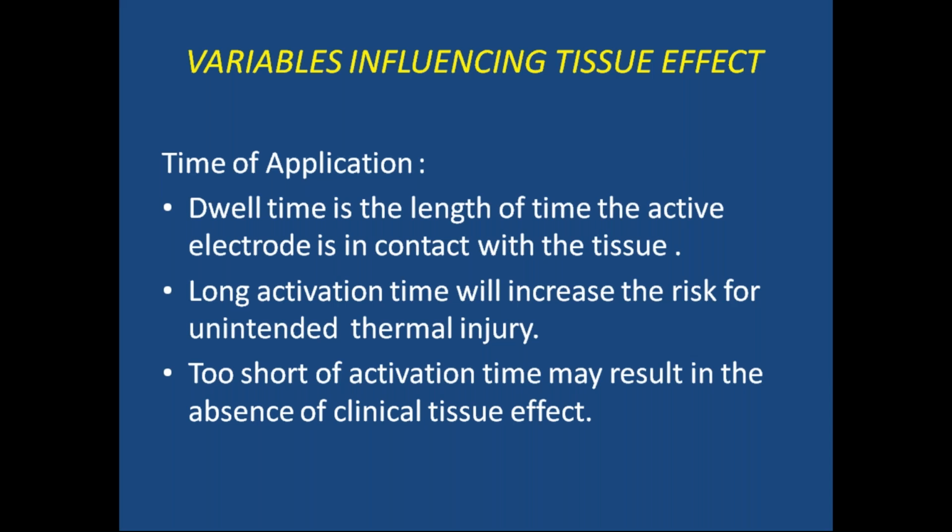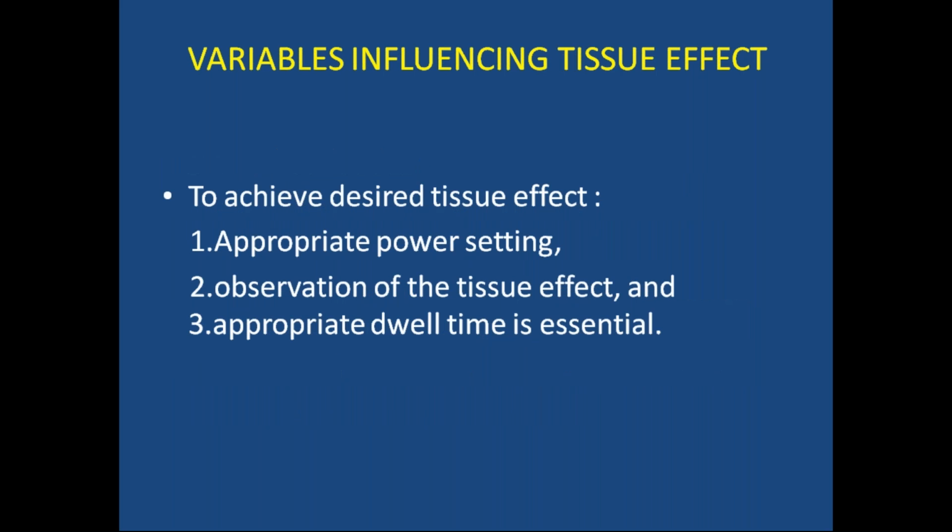Too short an activation time may result in absence of clinical tissue effect. So not too long and not too short, it must be medium. Okay. To achieve the desired tissue effect, appropriate power setting, observation of the tissue effect, and appropriate dwell time are also essential.